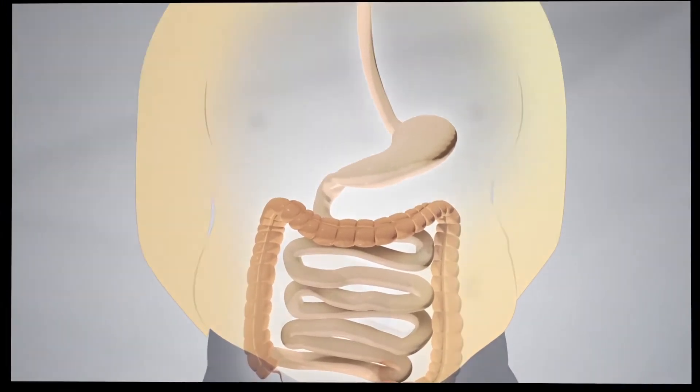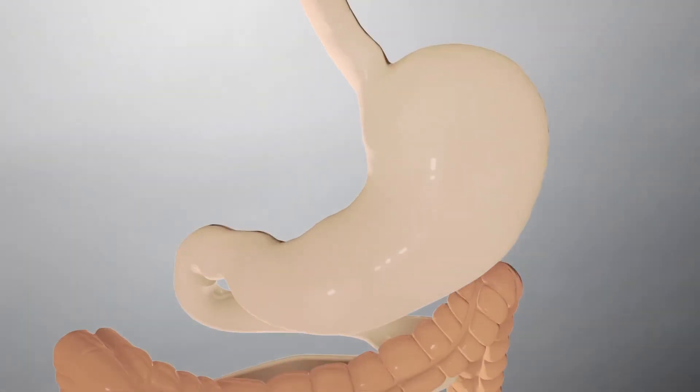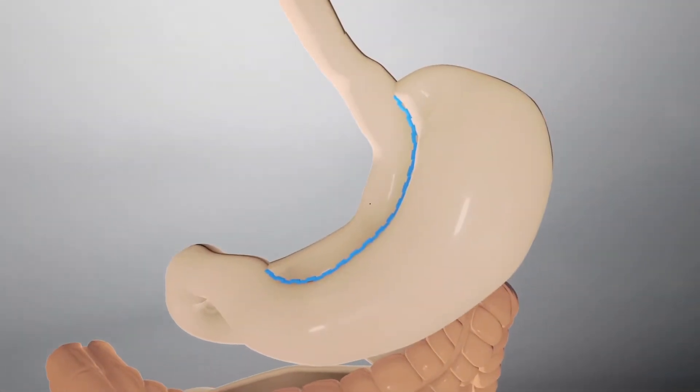The stomach is permanently divided with a stapler to create a new stomach, or pouch. This step restricts the amount of food that can be eaten.